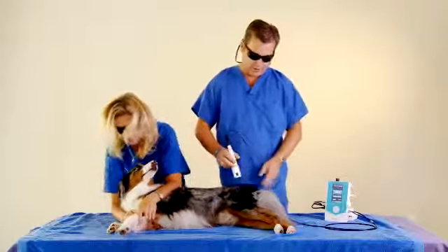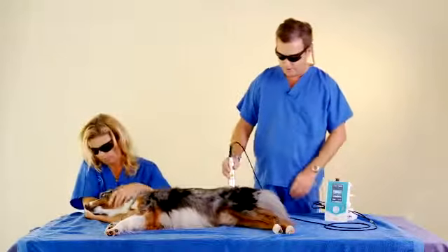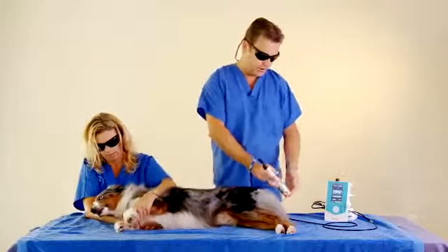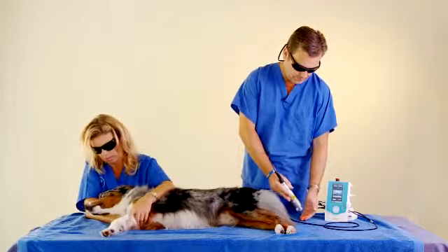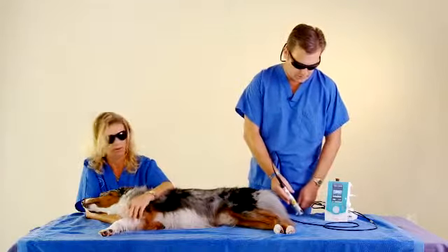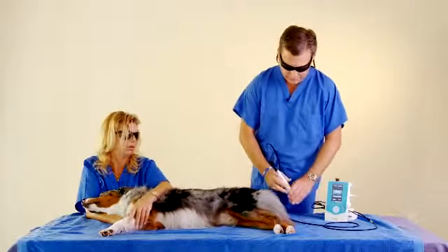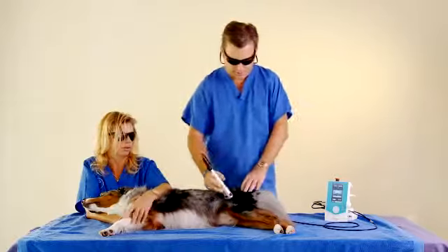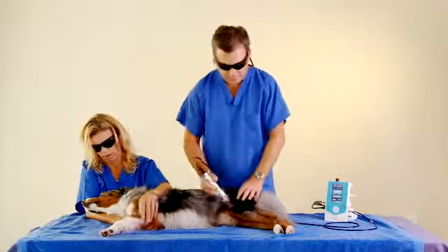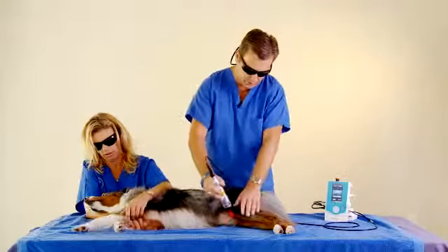Again, this is just training, so we're just going to use the targeting beam on the animal since we're actually not doing it. If we were actually treating him, I'll show you on the towel here. You depress the button, your laser is going to beep, and it's going to go through the protocols. So for training purposes, some of your techniques, if we have a TTA surgery, you're still going to get the depth you need without even touching the patient, just by going over this.